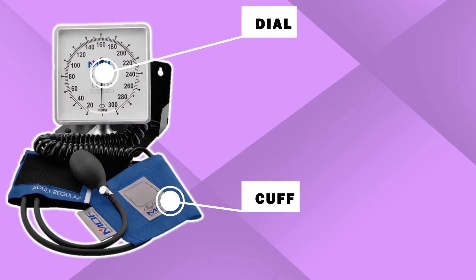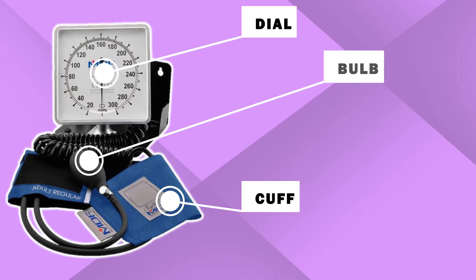All right, let's get to it. How to take a manual blood pressure — I'm going to go step by step. I filmed this off the clock, so was my very best friend Natasha. Let's get started with the parts of the sphygmomanometer, which is the BP machine. First, you have the cuff that you wrap around the patient, then you have the dial with the numbers, the bulb that you pump, and the air valve that you release.